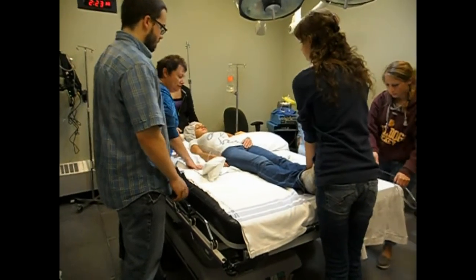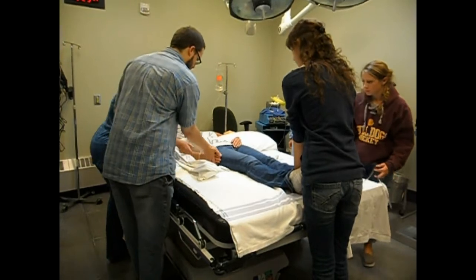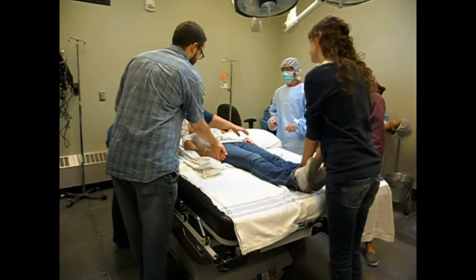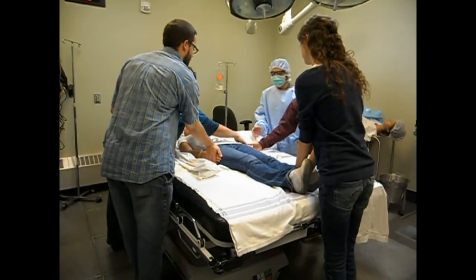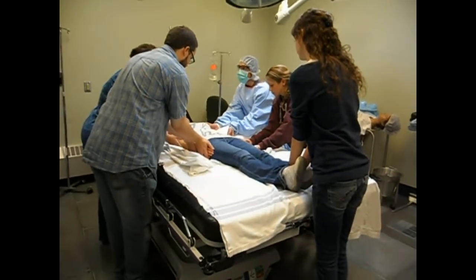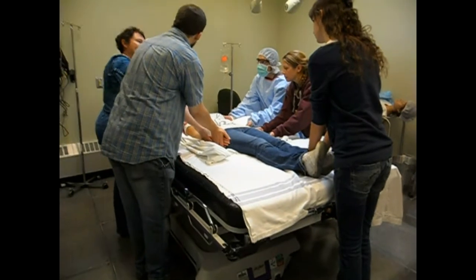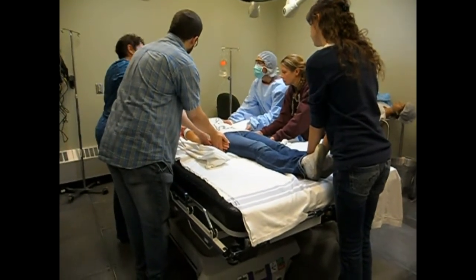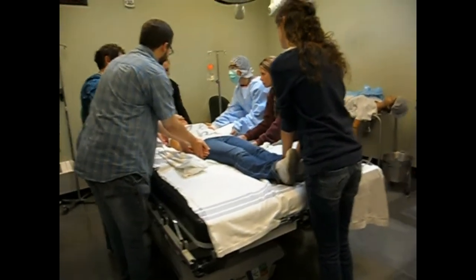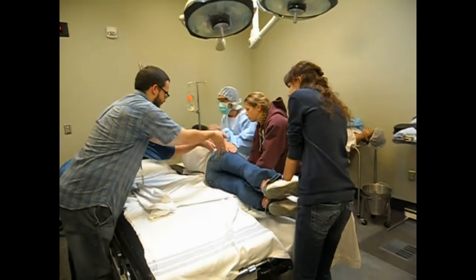So now what we're going to do is Jeremy's going to hold her hand to her hip, and I'm going to hold her elbow here. Can you see that? And you guys are going to do the same. Hold a hand and a wrist and a kind of an elbow and a shoulder. Okay, now we're going to just roll her on three, but anesthesia is going to disconnect the oxygen hose from the endotracheal tube. And so we're going to say, Randy, are you ready to go here? Yes. All right, on three. One, two, three. You guys are going to catch her.